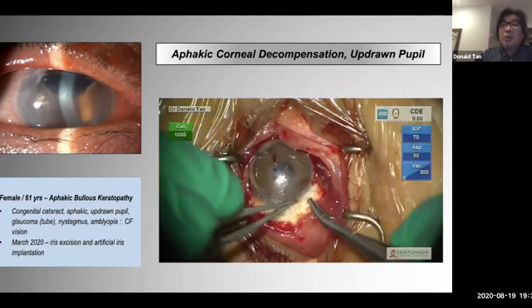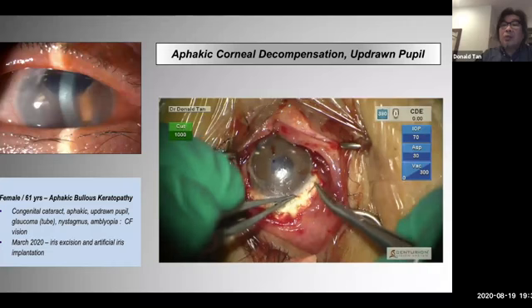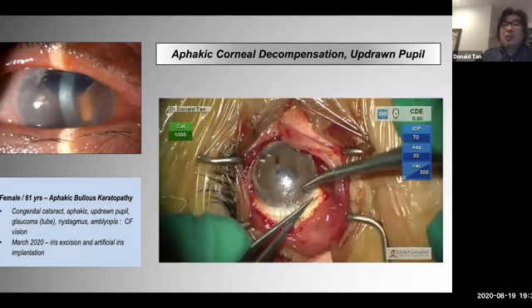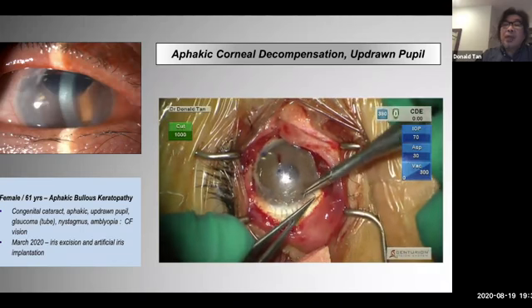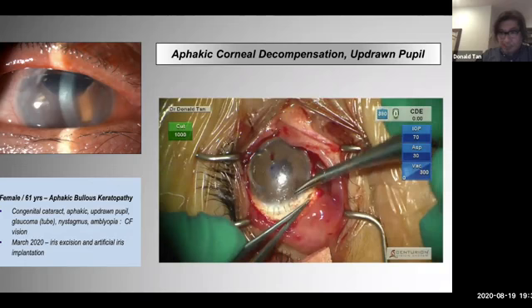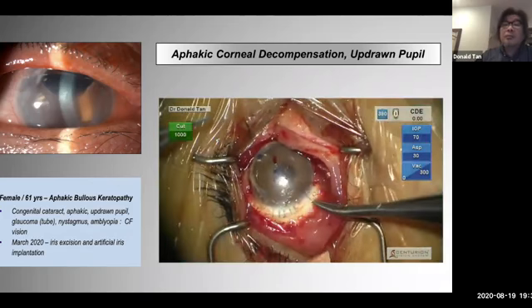All right, and you can see here that slit. It's important because we bury the knots, and then I will suture this. You see that's a partial thickness incision. So to prevent any leaks, I will use maybe 2 or 3 sutures just to close that up. And then close the conjunctiva.